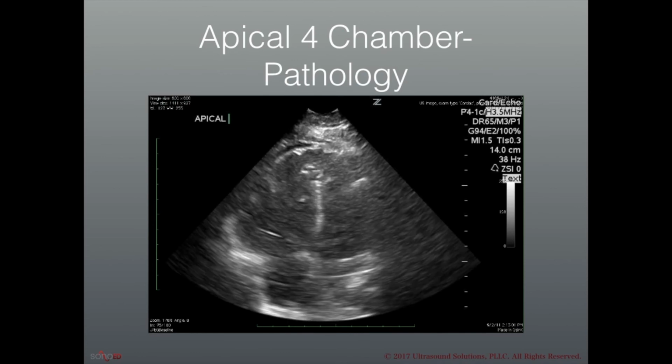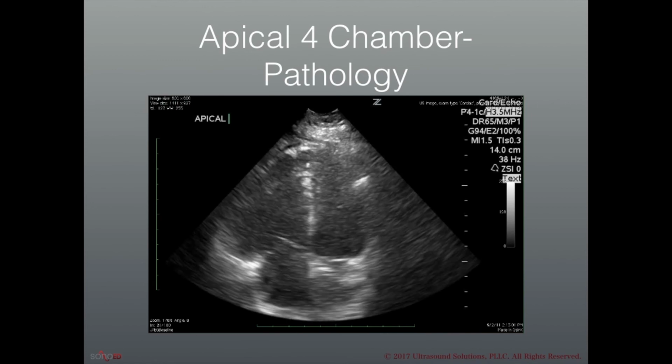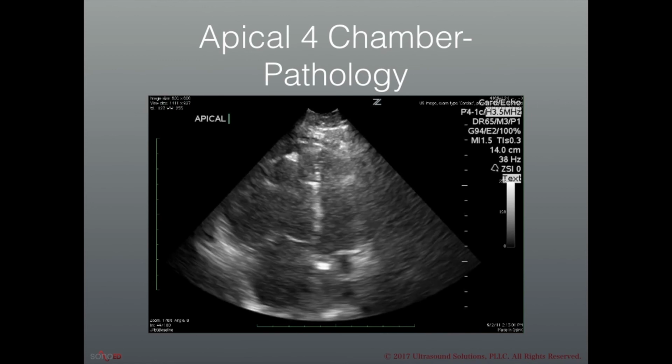There's really no other significant findings in this view. The left ventricle seems to be contracting well. There is a trace pericardial effusion right at the apex.